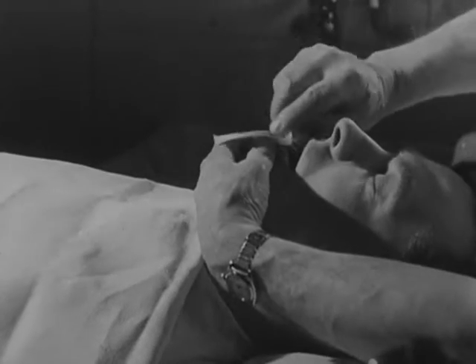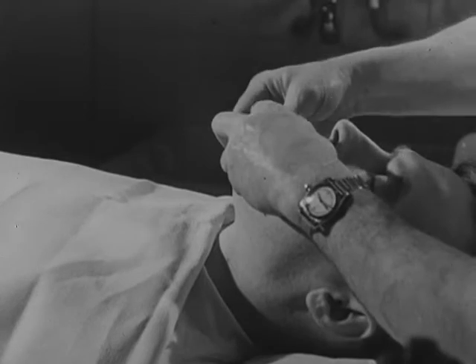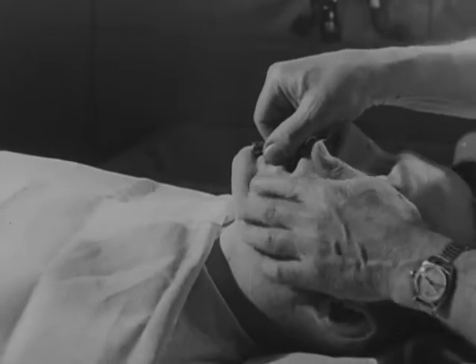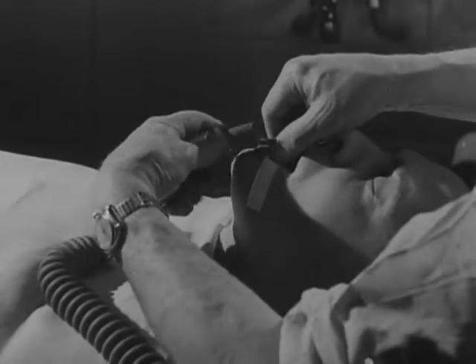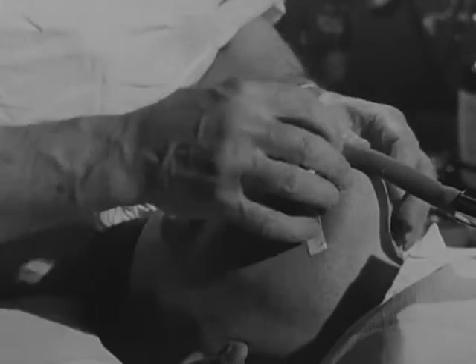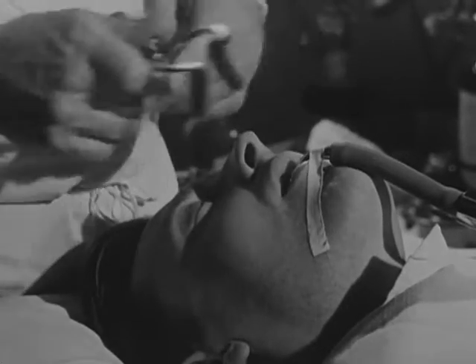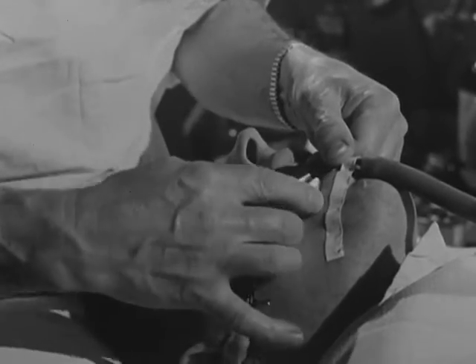When it is in the trachea, and there should be no doubt about this when a laryngoscope has been used, the metal connection should be strapped to the patient's face by adhesive plaster. The hose from the anesthetic machine is then fixed in position. When there is any likelihood of blood reaching the larynx, it is necessary to pack the pharynx carefully.